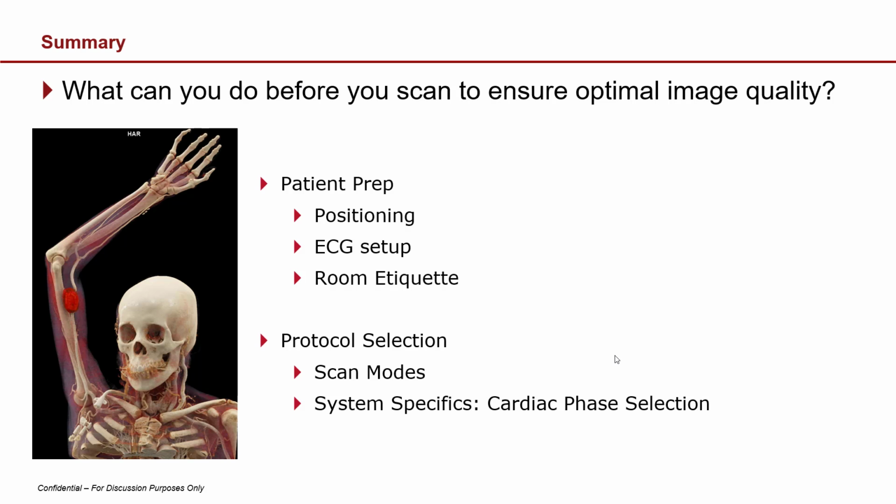So whenever you're imaging a patient, it's not enough to look at the protocol. You want to look at why you're doing this exam. So check out the reason for the exam and try and match that up with the scan mode that you're going to use in order to optimize your exam for your patient.